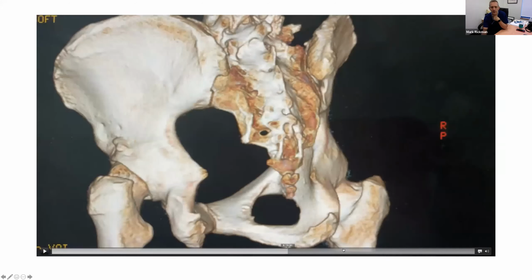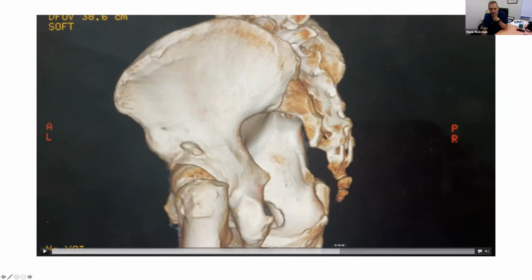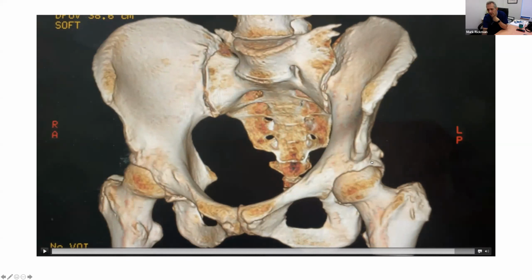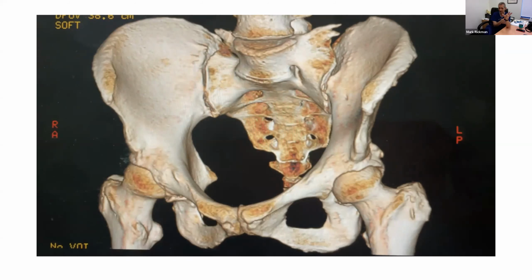Whereas her other hip is different. Her other hip, she's still got some subspine impingement. But what you're seeing on the X-ray on her is this little thing here, which is beyond the spine, and that's actually labral ossification. So she's got subspine impingement and she's ossified some of her labrum. And these are all different types of pincer impingement. So the subspine is relatively uncommon, but you see it. Labral ossification is something that typically affects an older group. She's the classic person that gets labral ossification. They're 20 years older than normal hip scope patients, and typically female for some reason.